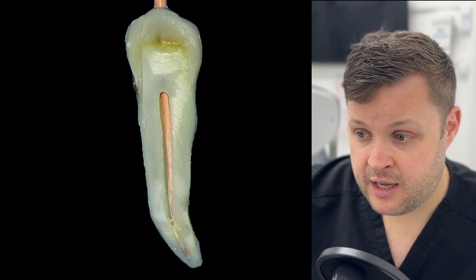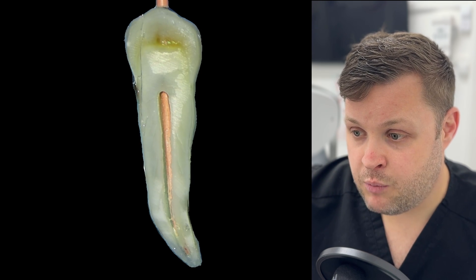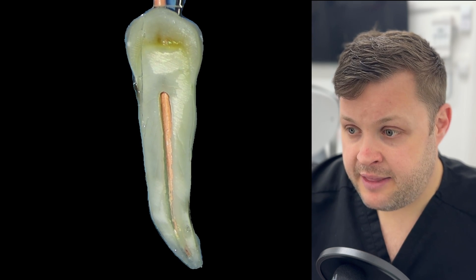We're going to use AH Plus resin-based root canal sealer to complete the warm vertical technique. We're going to coat the matched cone with the resin-based sealer and then fit it to length — and then this is where it's a bit squeaky bum time.